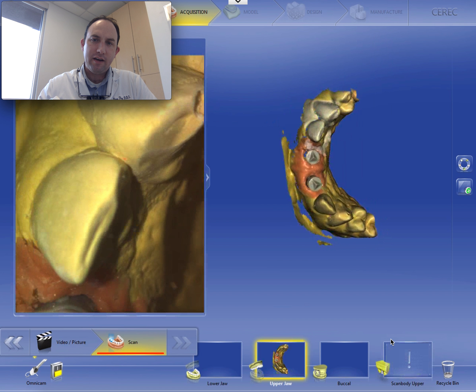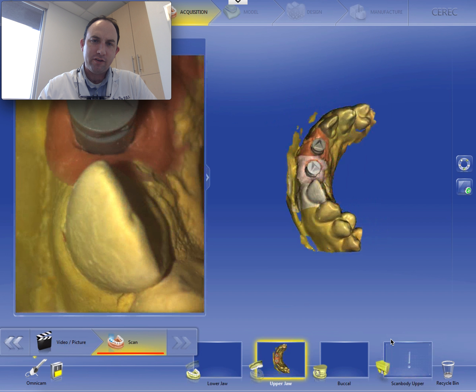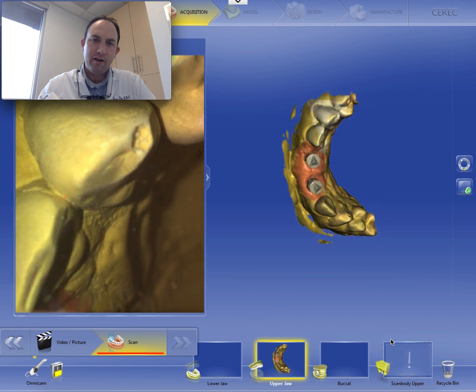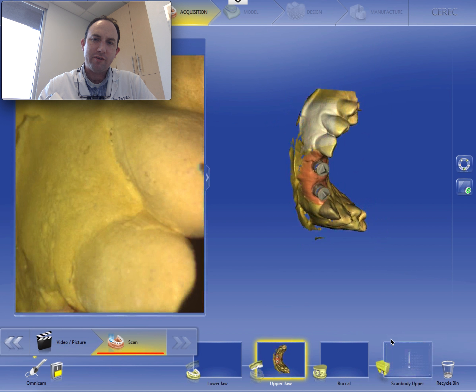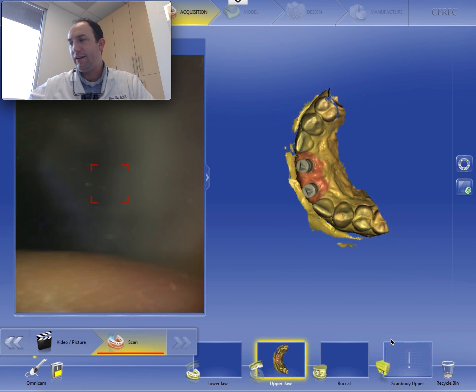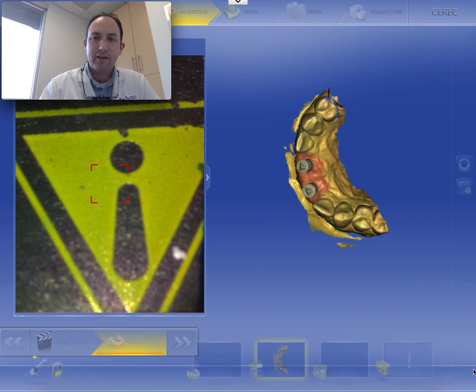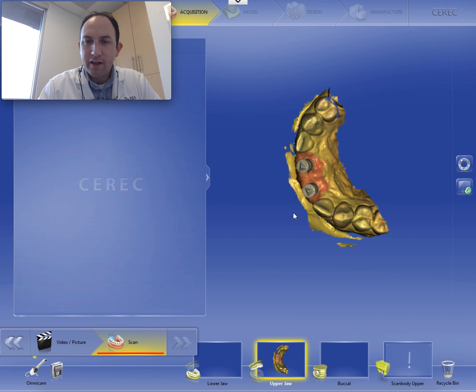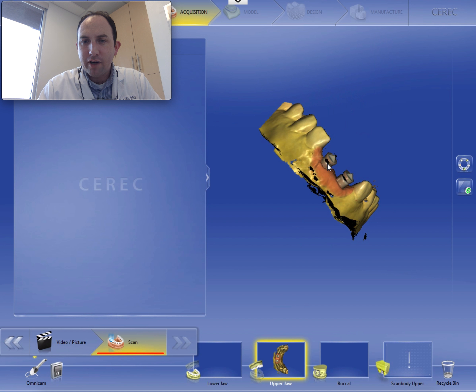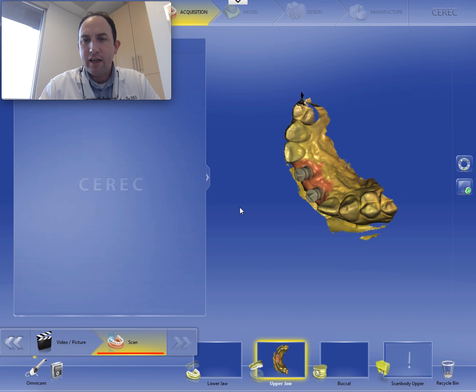I've learned through the years that less is more when we're scanning. Now that comes with some warnings — you always want to make sure you have a very solid imaging set of the tie bases in particular in the area that you're restoring. But everything else you can skip some of. So here's our image set of that upper. We've got a little bit of extrapolation right in these areas. I've got canine to canine, which is great.